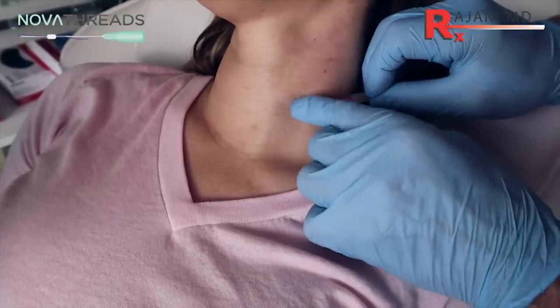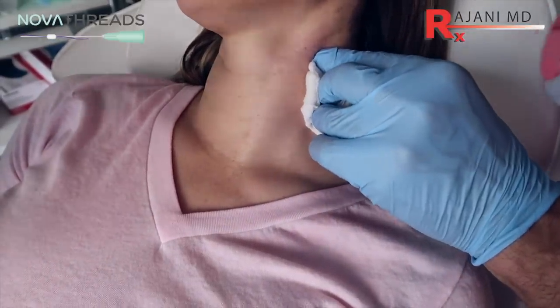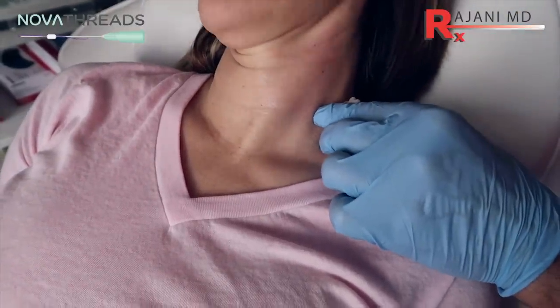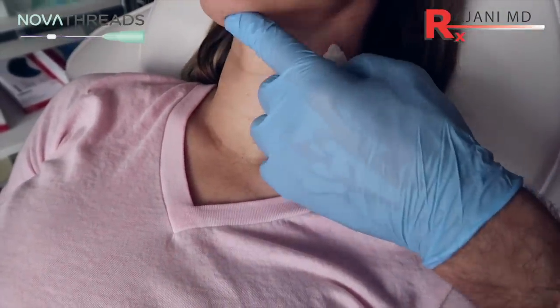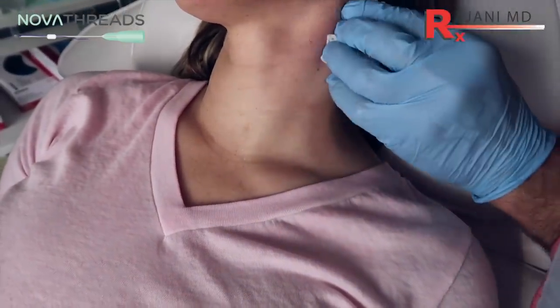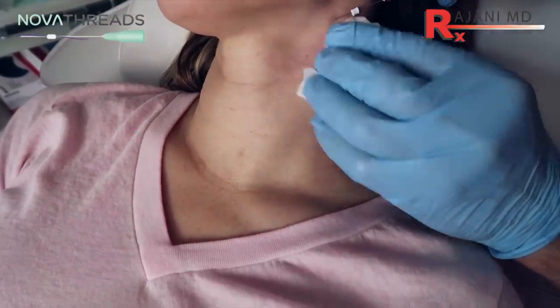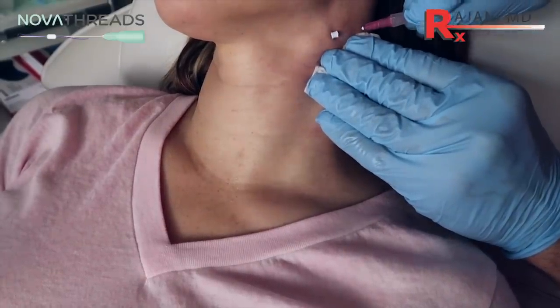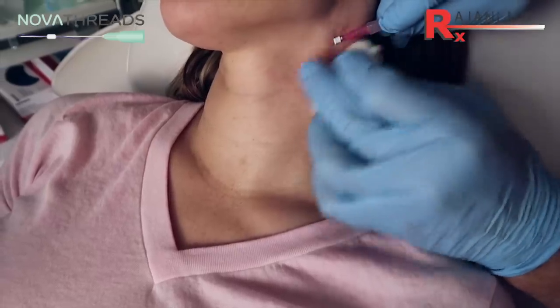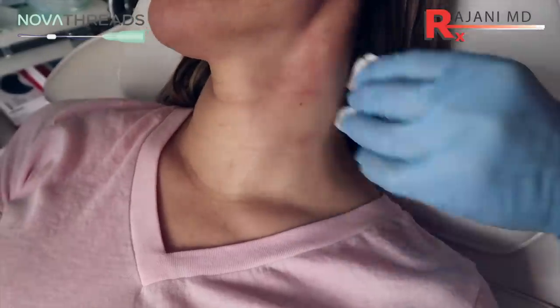Doing the neck, sometimes you'll get a little bruise because there's some vascularity — sometimes, like these, there's no blood involved at all. They can be very quick to do and well tolerated by the patient. I want to support this tissue because invariably when she's having dinner, she's out with somebody and she's going to look down — I want to get those lines too. So it's not just what we see in one dimension, it's three dimensions, and we're looking ahead years.